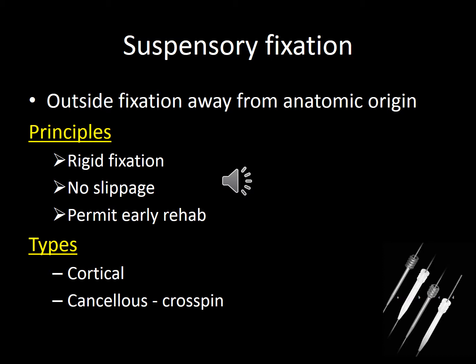In cancellous, crosspins. The crosspins are bioabsorbable as well as titanium. It crosses the graft at the cancellous bone. There are more intraoperative complications as well as breakage of the implant. So this cancellous fixation is less popular in our part of the world.